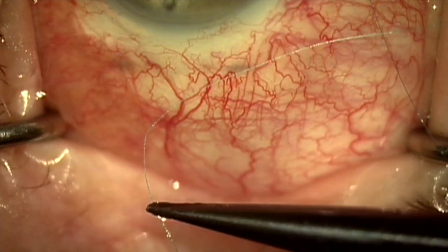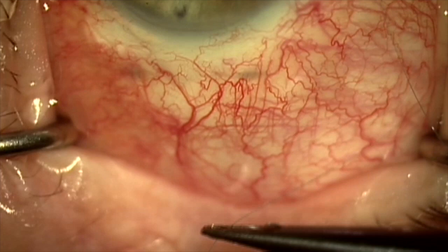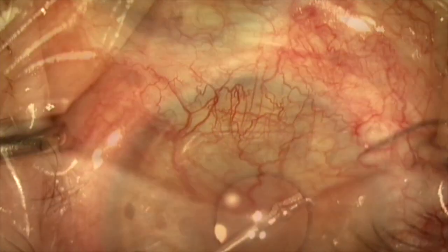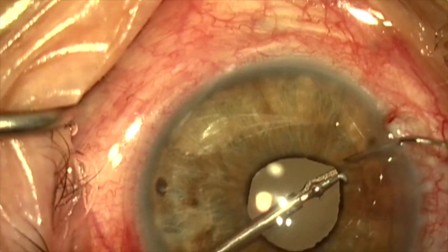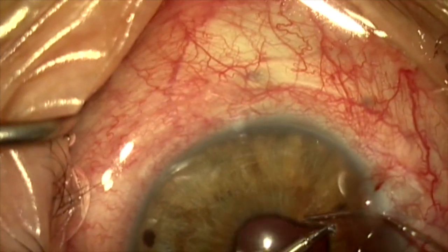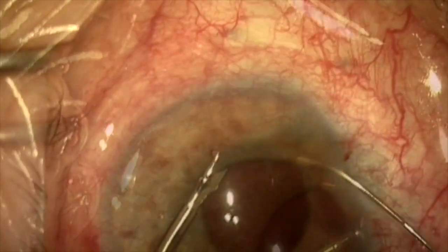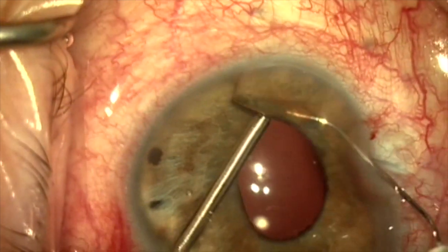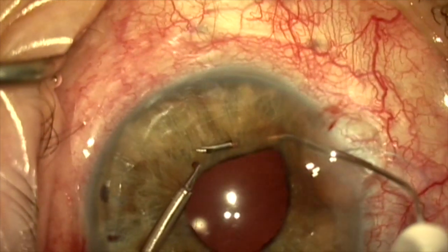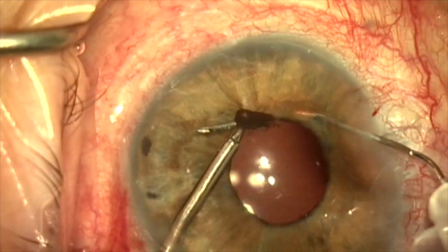Here I'm loading a 33-gauge hypodermic needle with a 10-0 prolene suture. The needle has been bent into a curve. I'm going to grab the iris margin at the sphincter and enter about one millimeter behind the iris sphincter, rather than doing a baseball stitch around the edge of the pupil.